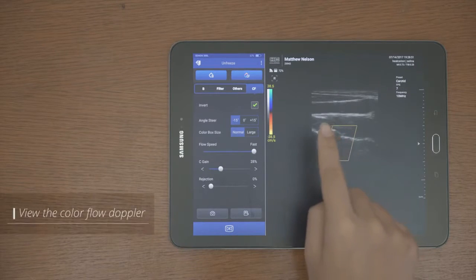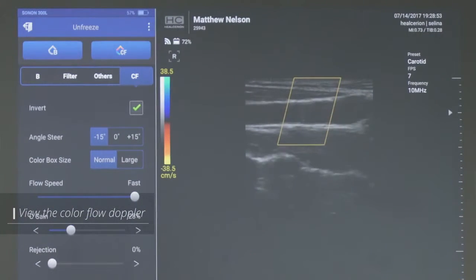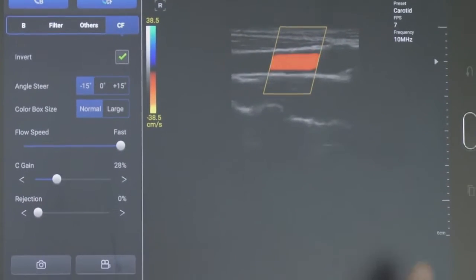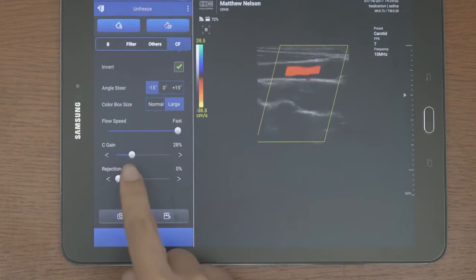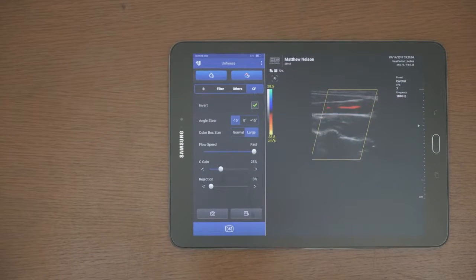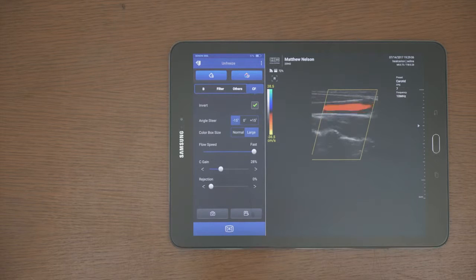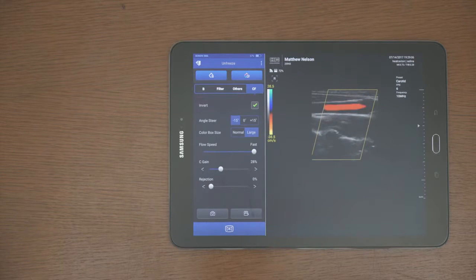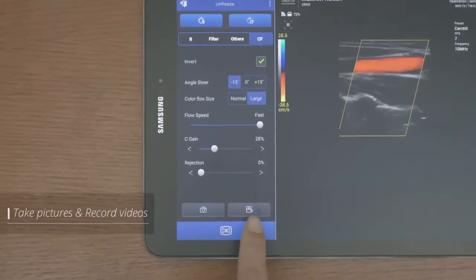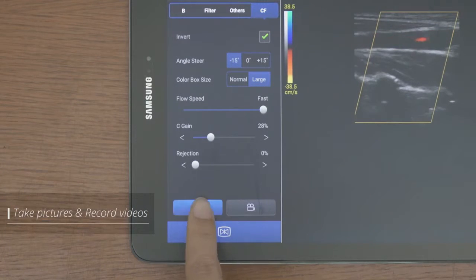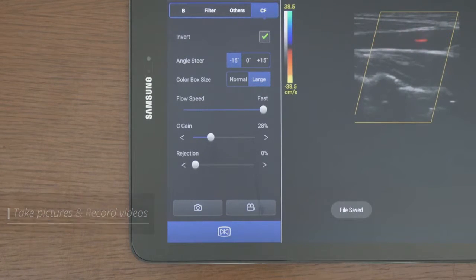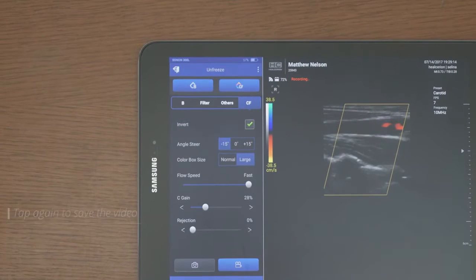You can tap the CF button to view the Color Flow Doppler image. And the color box is available in large size when the depth is over 5 cm. Please be aware that the color box cannot be moved while the scan screen is zoomed in. You can tap the camera and video recording button on the bottom left to take pictures and record videos.